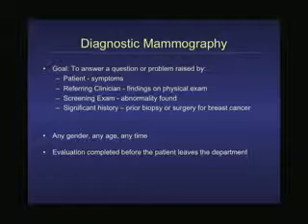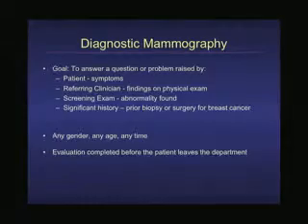And in this scenario, you can be any gender. We do men as diagnostic mammograms. We don't do screening mammograms on men, but if they have a problem, we will do a diagnostic mammogram. They can be of any age. There's no minimum or maximum age that we can do a diagnostic, and we do it when they have the symptom. So there's no interval that we do it on. That's only for screening. And the evaluation is completed while the patient is in the department. Whether they need an additional ultrasound or whatever, we have to answer the question while the patient is there, all right, and come up with a final evaluation of what is going on.